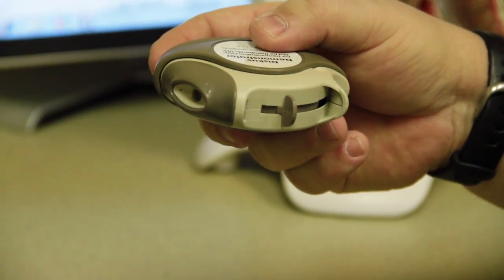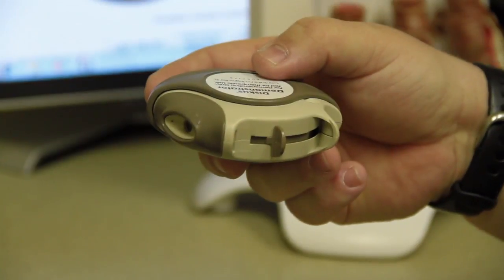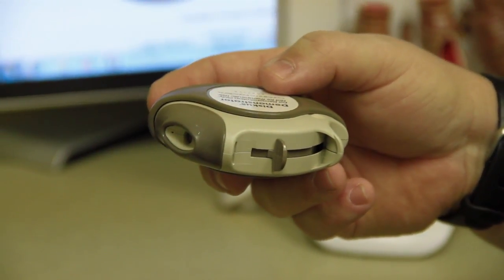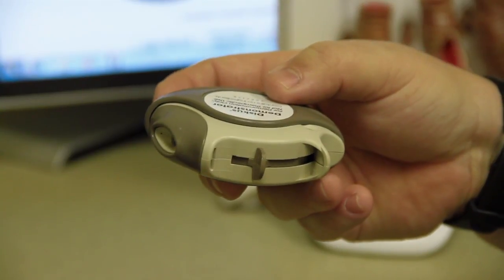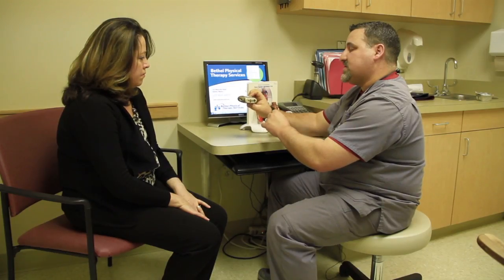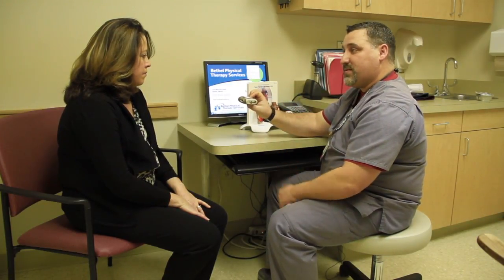Now, this is where you will wrap your lips nice and snug to inhale the medication. To load the medication, or to get the device ready to inhale the medication, there is a little tab here on the side that you're going to push until you hear a click, and that will load the medication into the device, and then it will be ready to use.